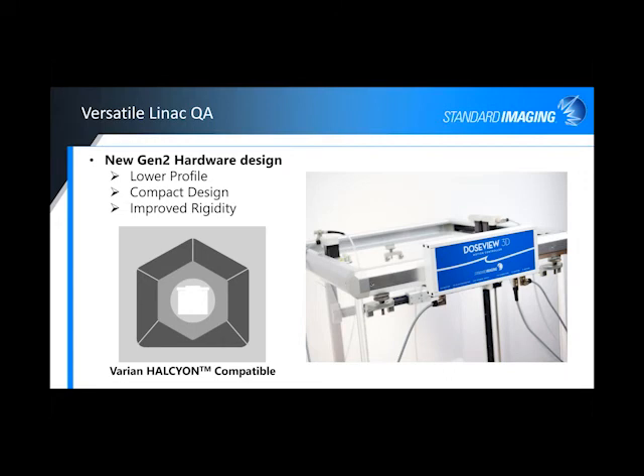The new Gen 2 hardware has a lower profile, it's a more compact design, with improved rigidity, and now it is Halcyon compatible. I know that was somewhat of a challenge with some of the other systems on the market — getting into the Halcyon bore — but our new system does fit and works very well with the Halcyon.